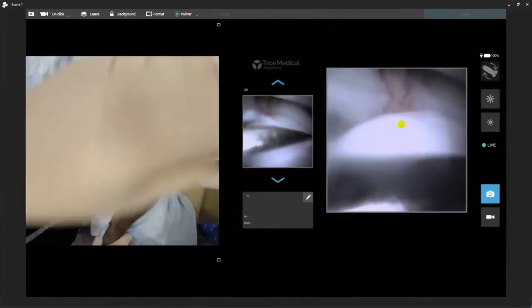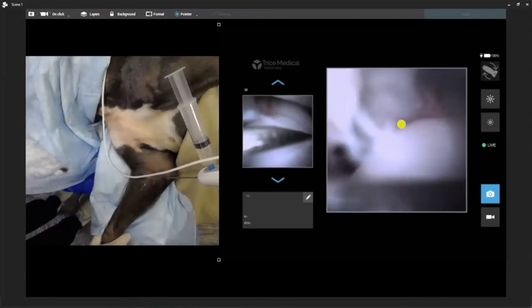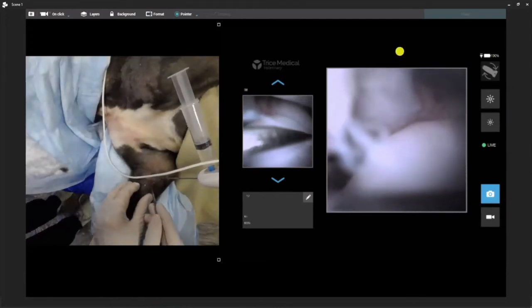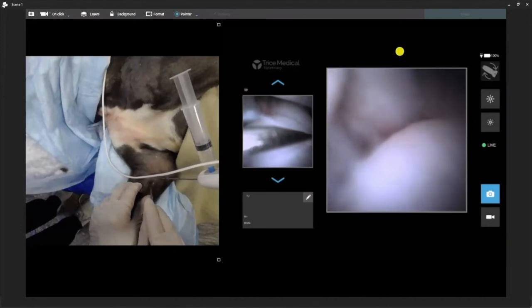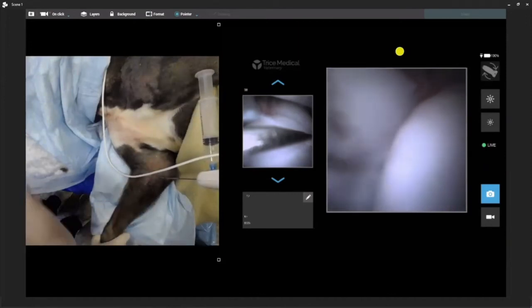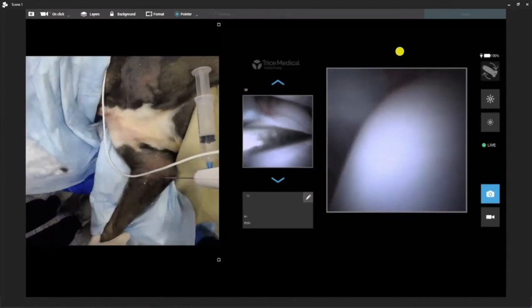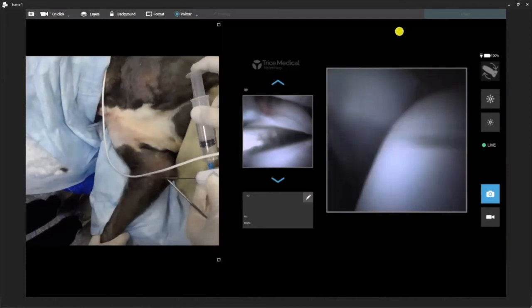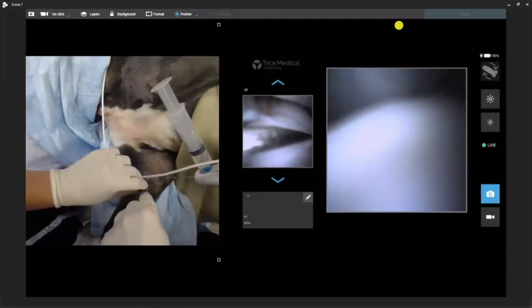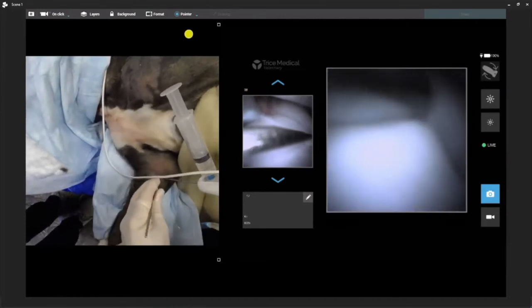Again, when we do this, I'm not a big fan of stabbing deep into the capsule. Let's do it through the skin only — one, two, three. There we go. Now what we're going to do is my switching stick. We know the needle is in the joint. I'll do a little puff here, and one, two, three with the needle — slide that out, one, two, three in with the switching stick. And we're going to go ahead and open a cannula.